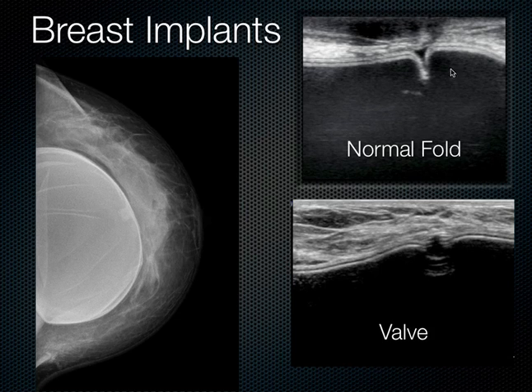And this is a normal amount of free fluid seen within the capsule. See, there's these two layers. This is the capsular free fluid seen there. That's normal to see. And I like this mammogram here because it shows how you can get these folds in the implant.